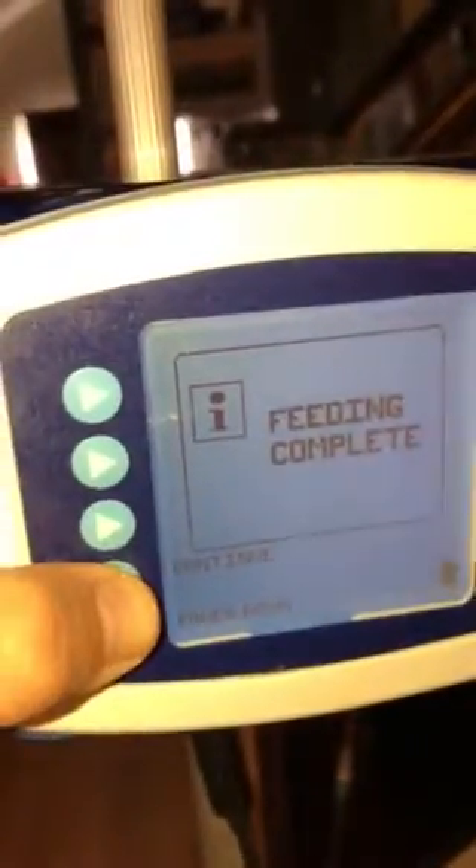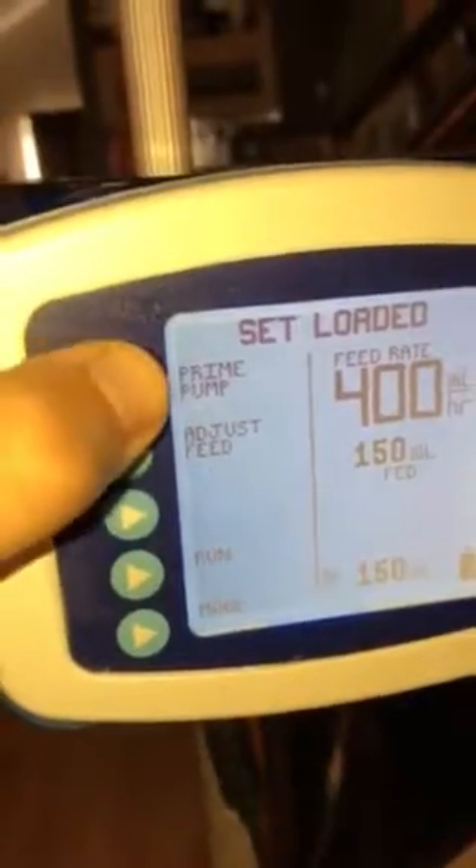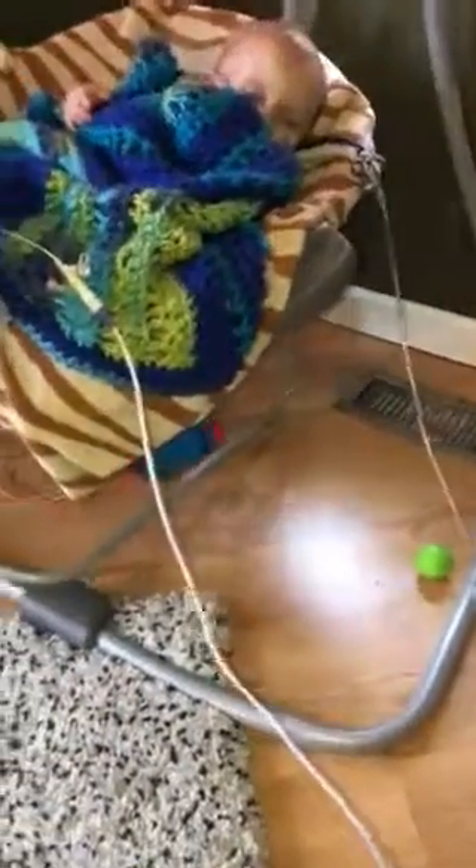So it thinks it's done. We'll hit continue once again, and we want to prime the rest of it out — hit the prime pump and hold the prime, similar to what we did when we were trying to feed the bag. We're waiting for it to get to the end.